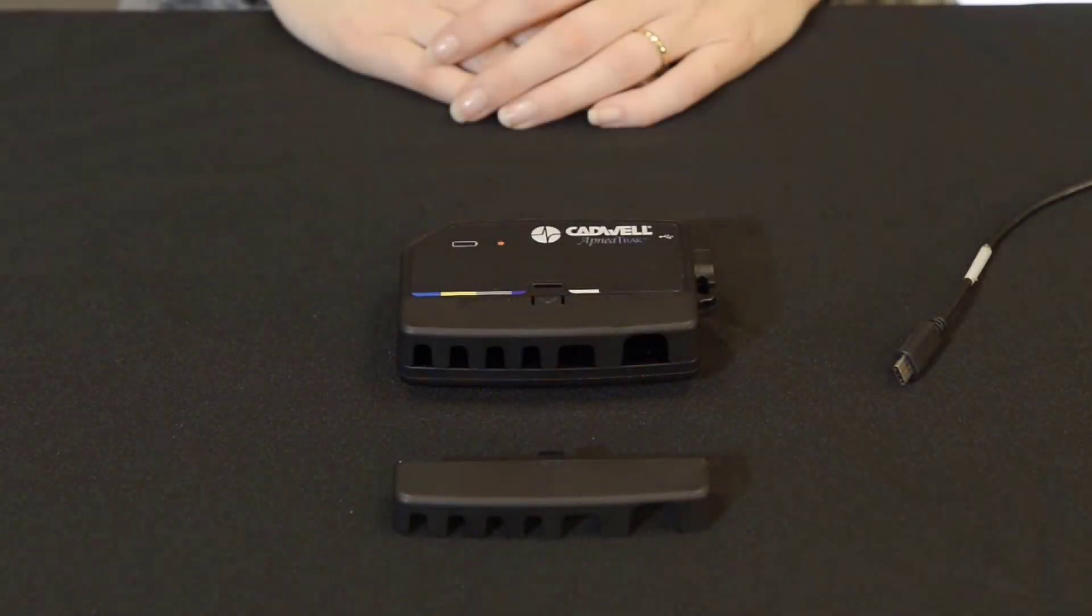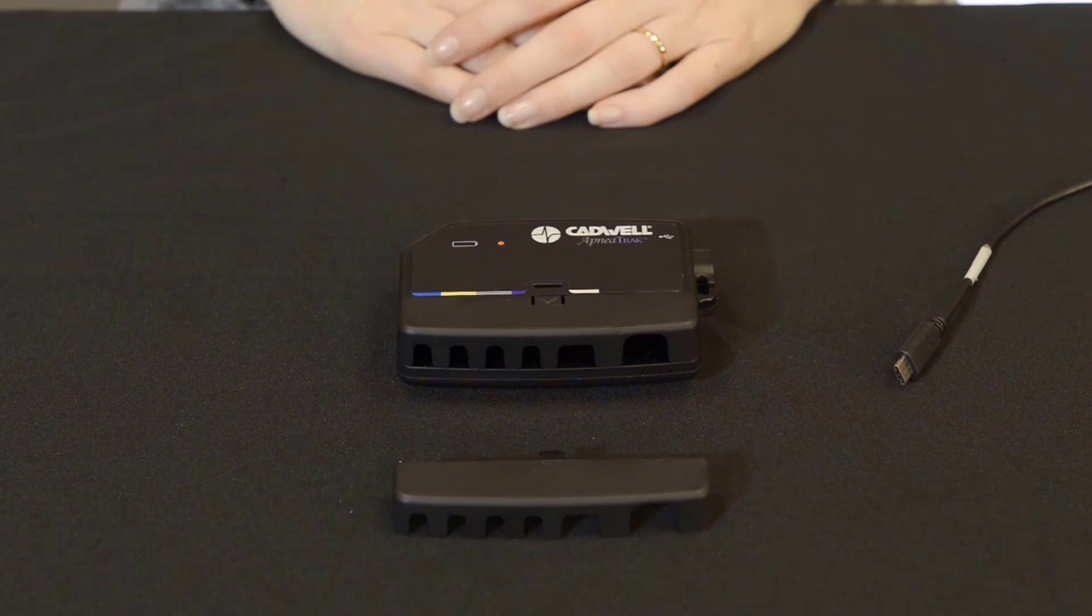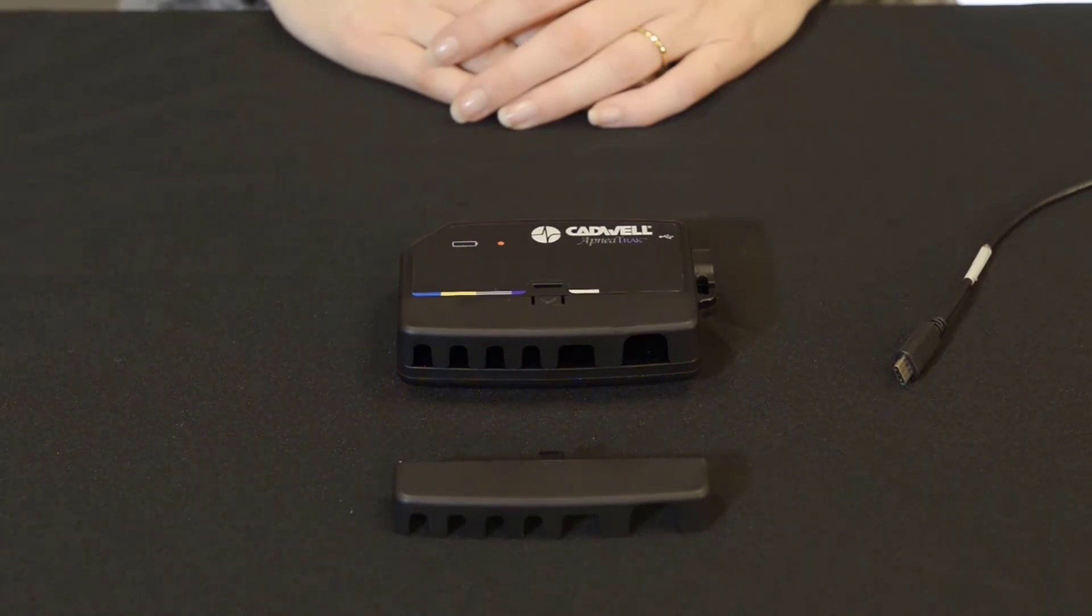Welcome to the quick start video guide to your new ApneaTrak. We will start with charging your device. Your device comes with a rechargeable lithium ion battery.